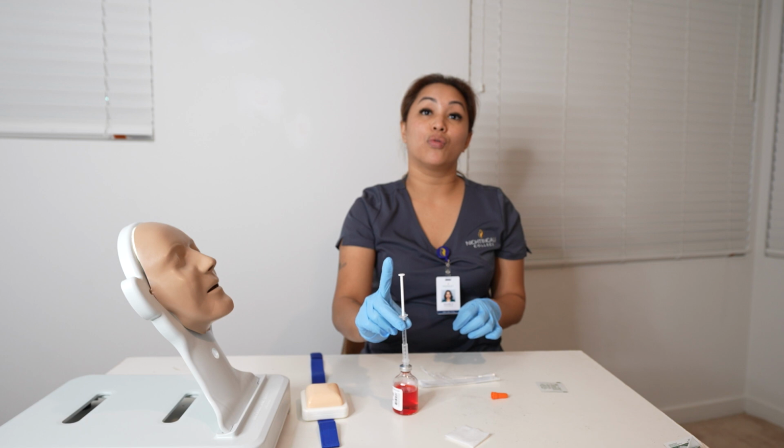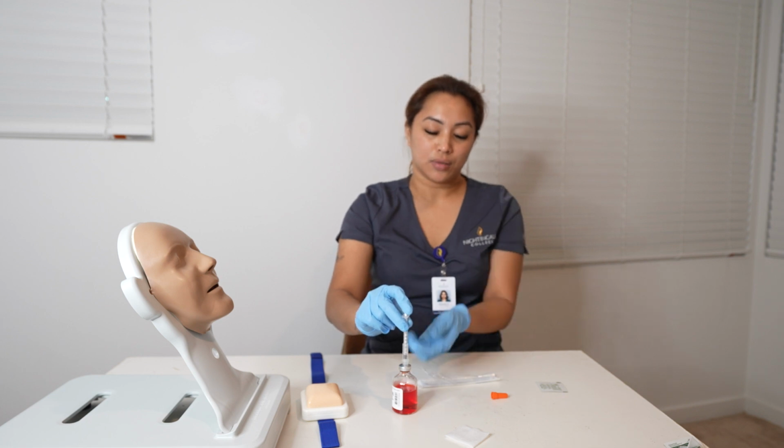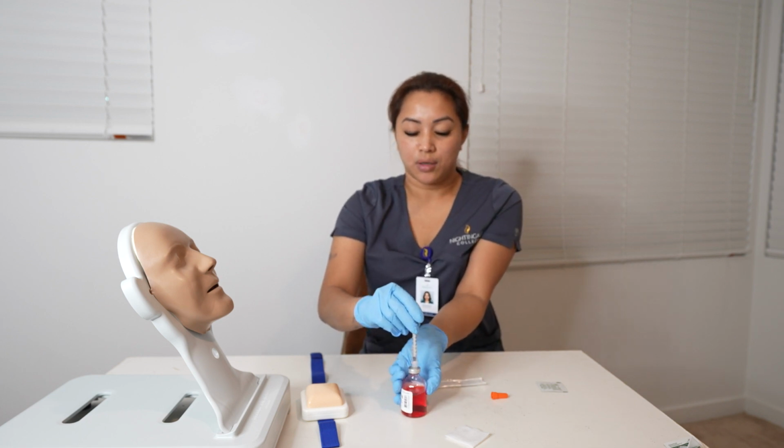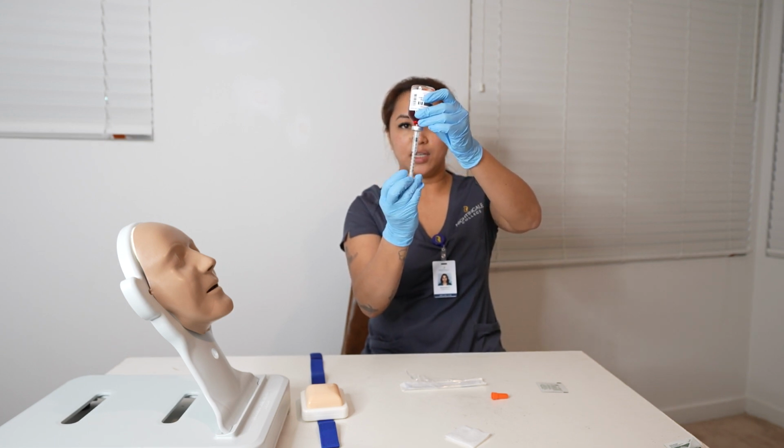Perfect. So now we are going to put the 1 ml of air into the medication vial, like so. Now we are going to invert the medication vial. Make sure that the needle does not bend.